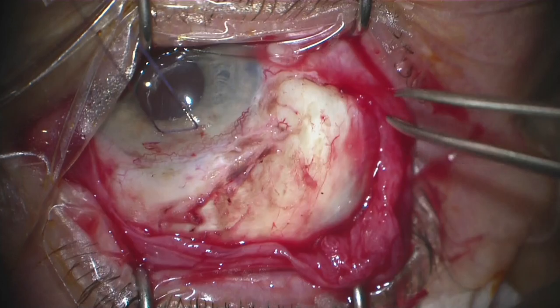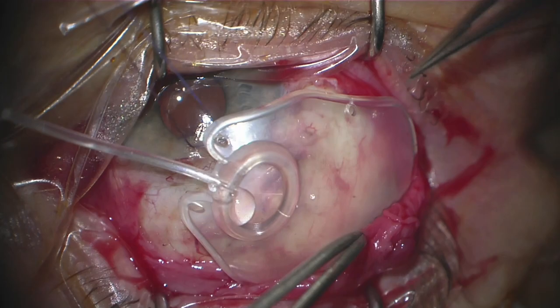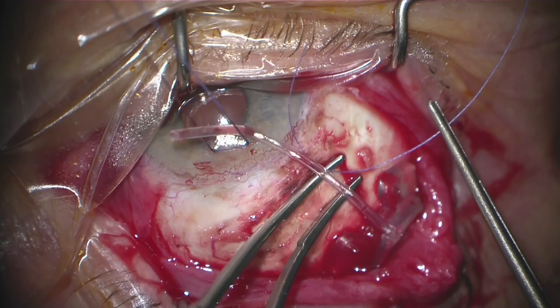I do like to hook both the superior and lateral rectus muscles and free them from their Tenon's attachments. I then will take the implant and place it in the supra-temporal quadrant.